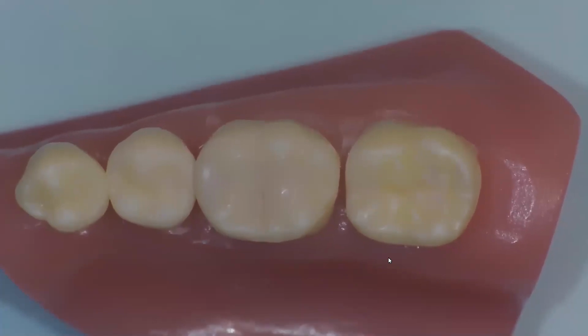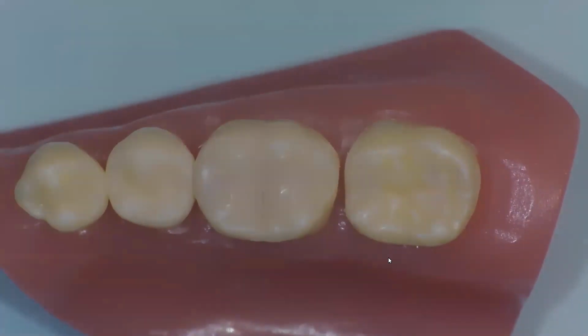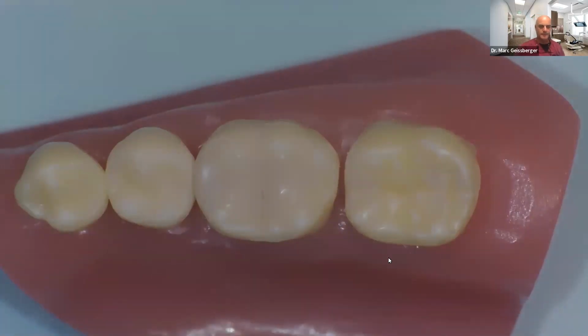All right. And do you have time for one or two more? Sure, go for it. What is the name of the composite warmer that you were using? Okay, so the composite warmer I use is a company called Addent, and it's called the Calset composite warmer. Yeah, look them up. Check it out.